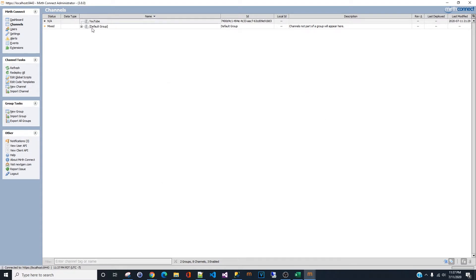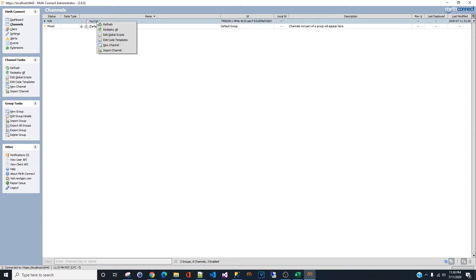We're going to focus on the YouTube group right here. This is the group where we're going to create the new channel. The default group contains my training channels, so don't worry about those. Right-click on the group and click 'New Channel'.